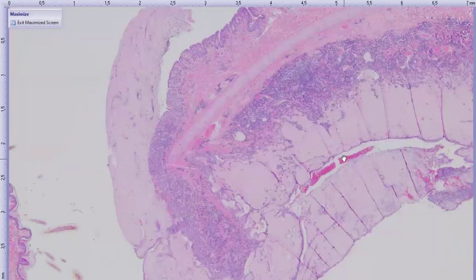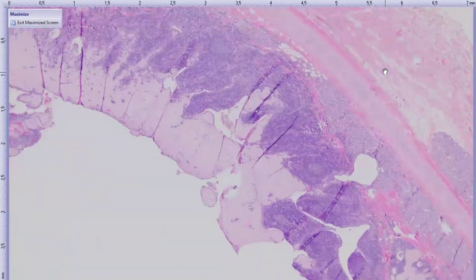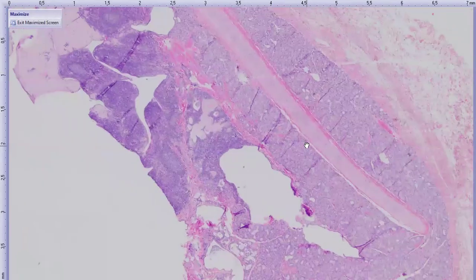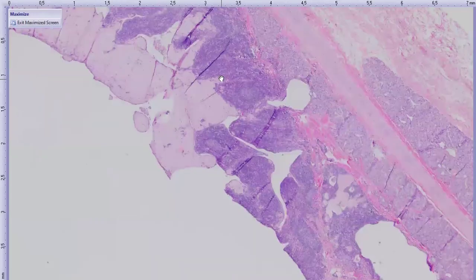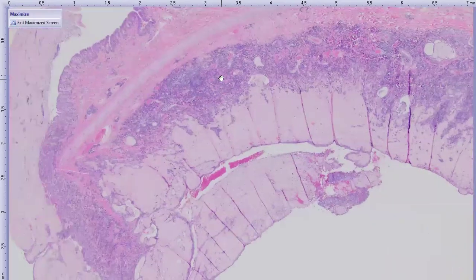All right, so again, third eyelid, got our cartilage, lots of inflammation here. You can, from the slow power, start to maybe pick out a few lymphoid follicles, and then our gland, the third eyelid here, maybe a little bit inflamed, but otherwise not too bad. And so our infiltrate here, closer.